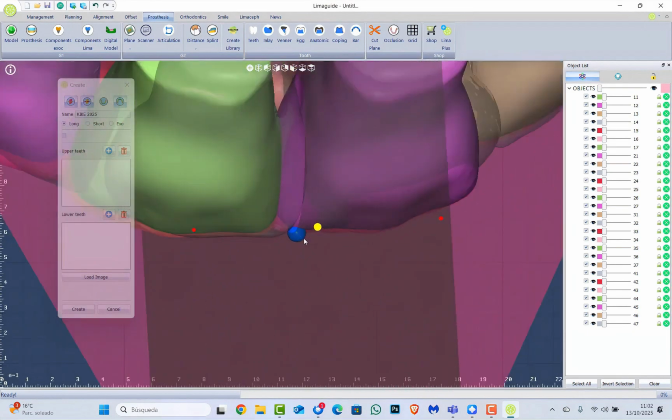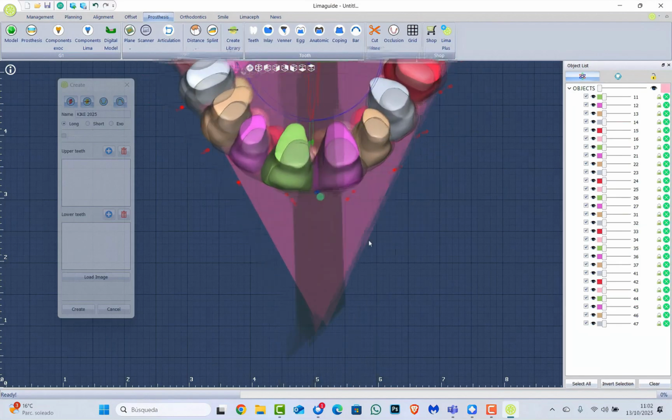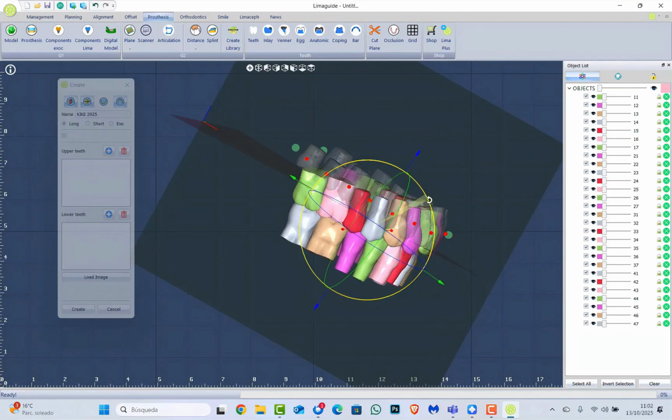If we zoom in, we'll see this blue dot here. This would be like the pointer of the articulator, because in this plane of work, we're working with the Lima articulator that already comes with the software. I'm just going to move it to make it fit a little more.